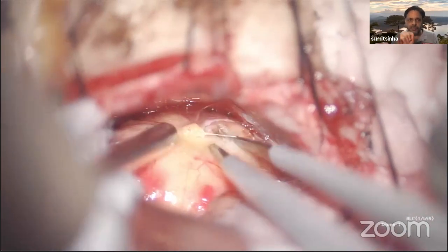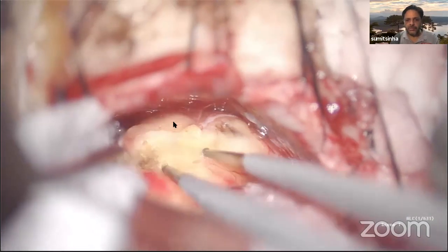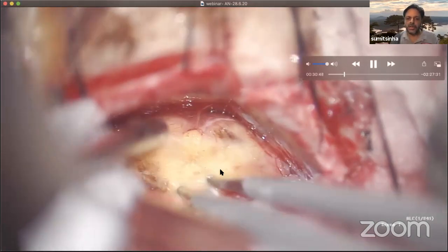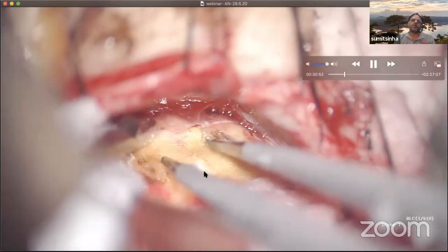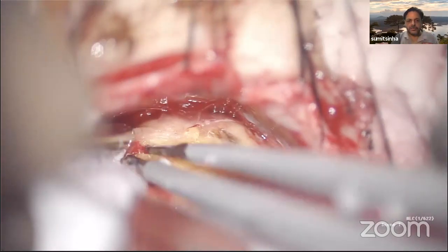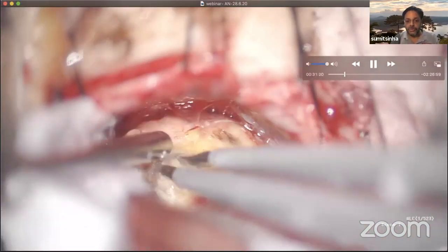Now, the second step, decompression of the tumor, is in process. And you see that I am coagulating the tumor capsule. There is no tumor arachnoid here, so I am allowed to use my bipolar over here and coagulate the tumor capsule. And then we'll be cutting it, making a window in the tumor capsule in order to go inside the tumor and use my CUSA to do the decompression and debulking of the tumor.